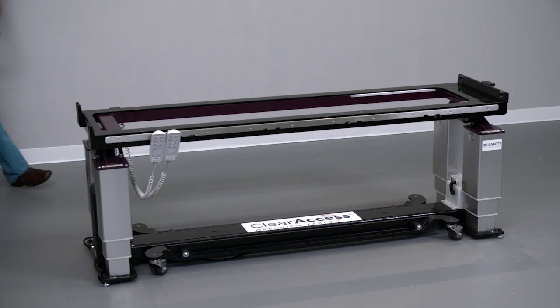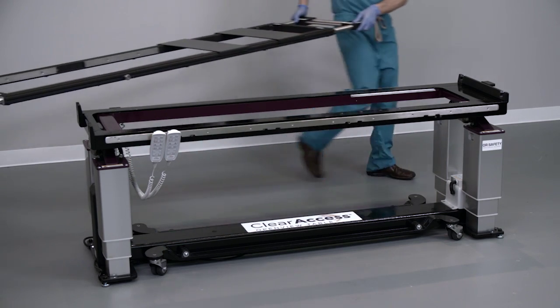To do this, bring the prone platform over the table and lower it carefully into the cradle.